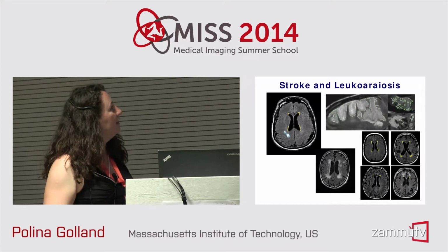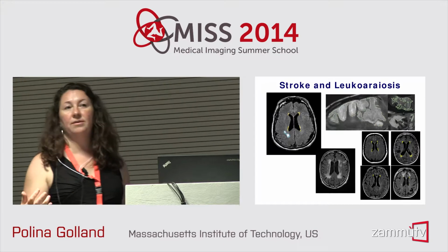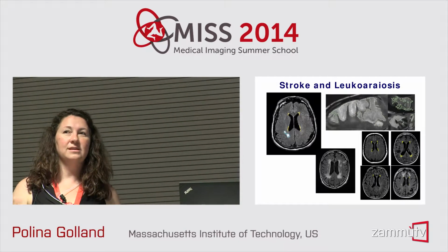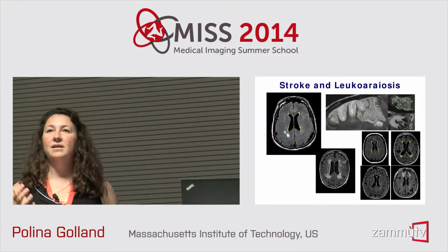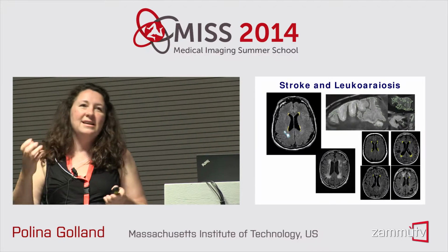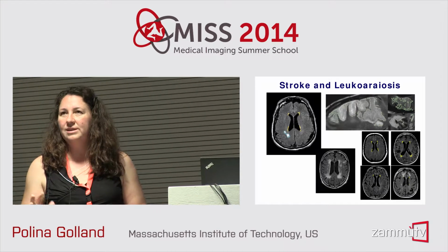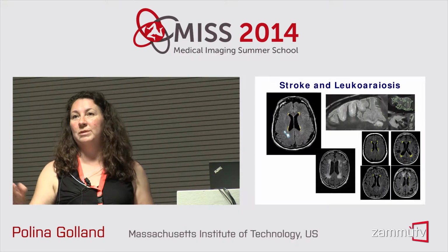These faint yellow lines outline a manual segmentation of what's called white matter hyperintensity. The real technical term is leukoaraiosis. Leukoaraiosis is an elusive notion of damage to white matter due to some cerebrovascular problems. Some people think that it's microbleeds, some people think that it's degeneration of vessel structures. Nobody really has a great model of leukoaraiosis. But what we know is that all of us get it as we age. It's a normal part of healthy aging.